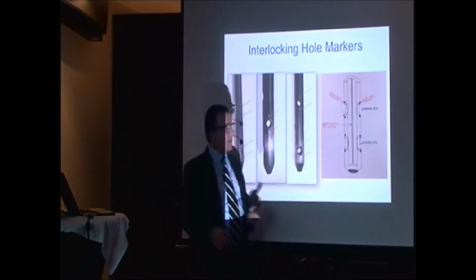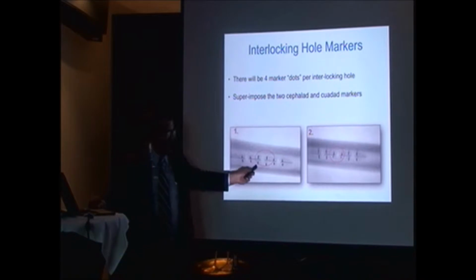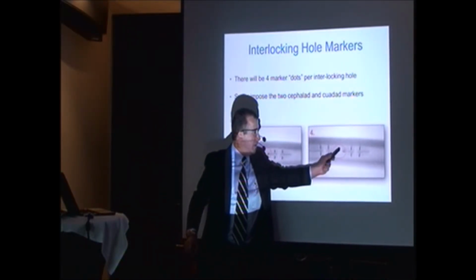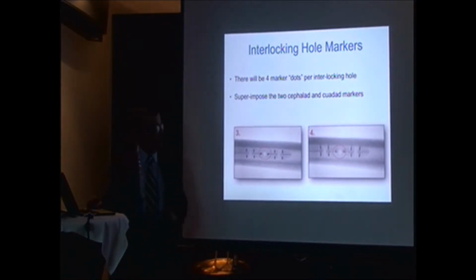of the hole. The whole idea is you have to superimpose the 4 markers. When you look perpendicular, you have 4 points like this. But when you rotate and get them superimposed, the 4 points become 2 points. You can see sequentially as you rotate either the leg or the image, it becomes 2 markers. With these 2 markers, you can even see the outline of the hole. These 2 markers tell you the limits of the nail hole.